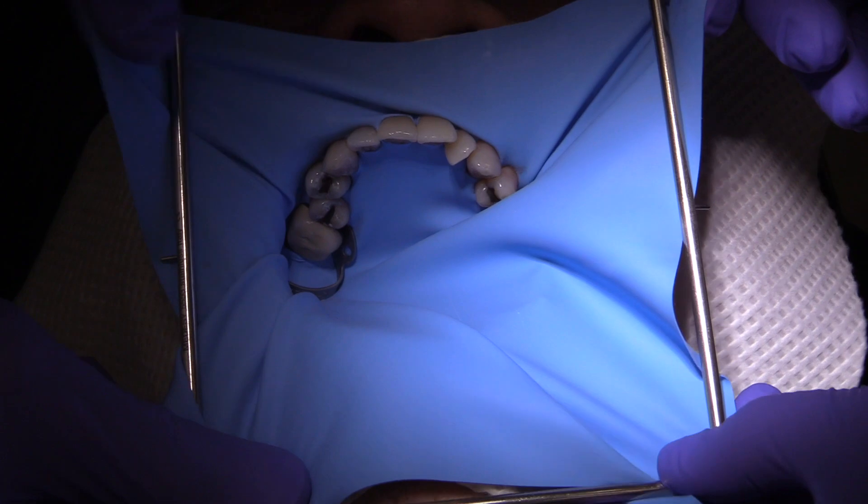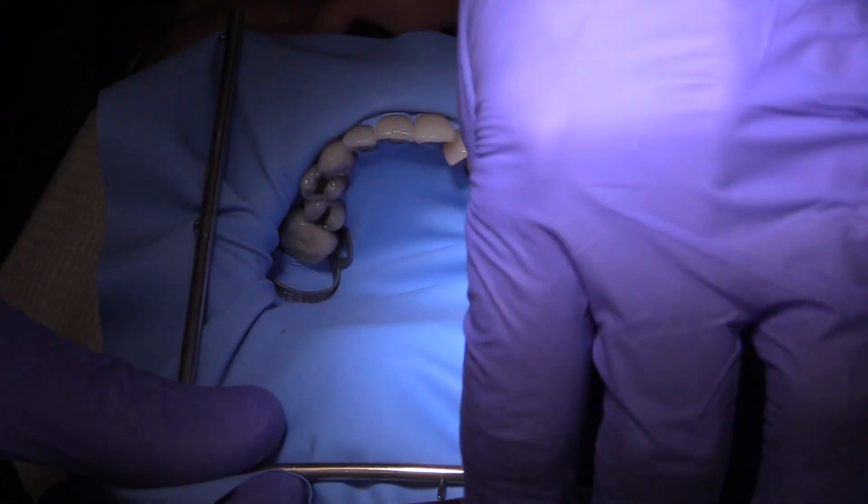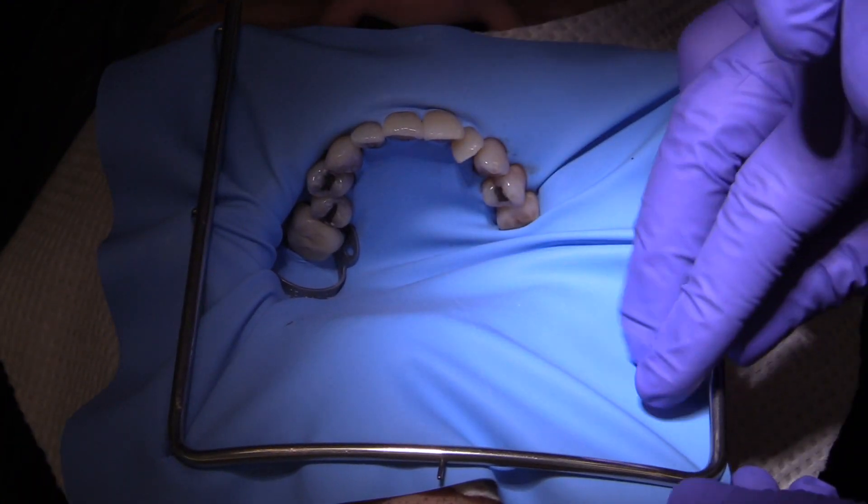You don't want leakage pushing up against the patient's face. These rubber dam napkins are, I think, essential to a very comfortable rubber dam placement.